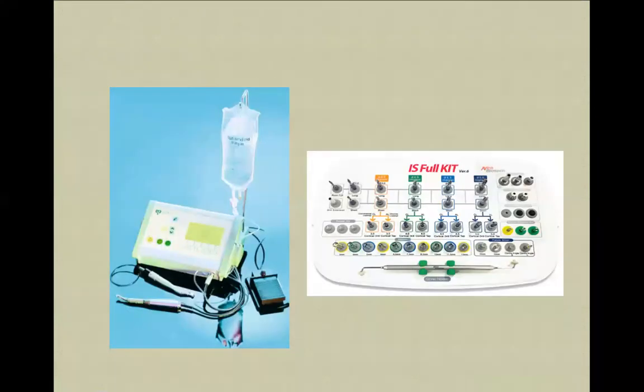Instrumentation. Well, we discussed that I think many times, that we have standard sets for the oral cavity, and they are usually more or less the same. They will include some instruments for retraction, for incision, for cutting, for suturing, for subperiosteal separation.